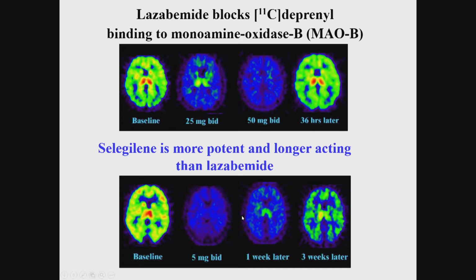So what we're seeing in the bottom slide is actually the synthesis of newly made MAOB, replenishing what had been irreversibly inhibited by selegiline.